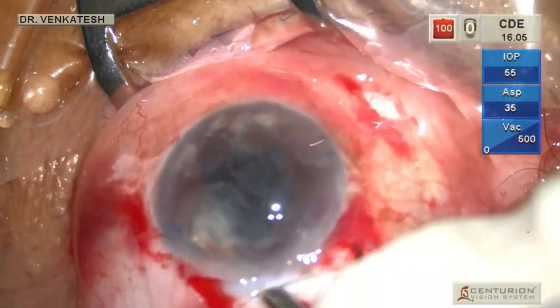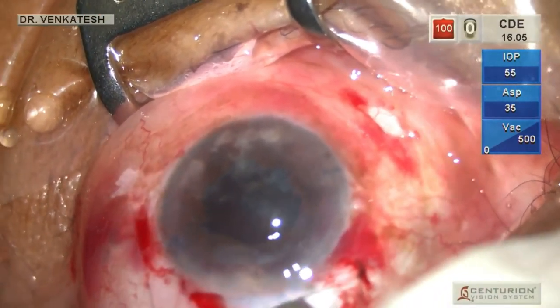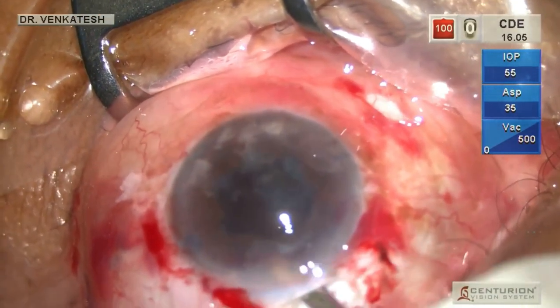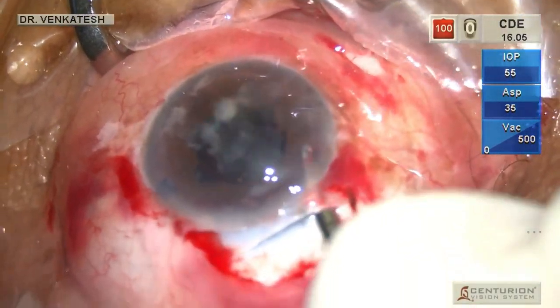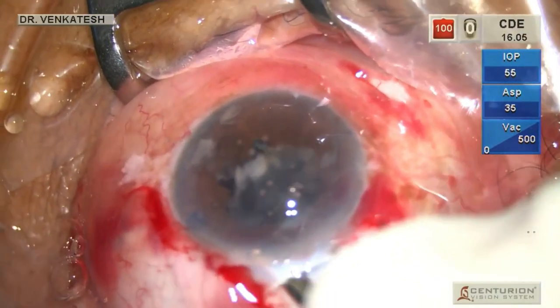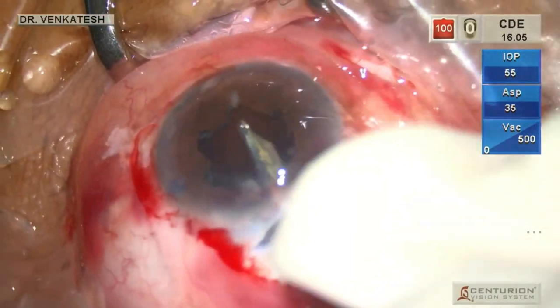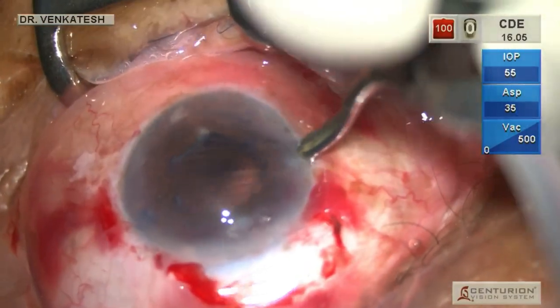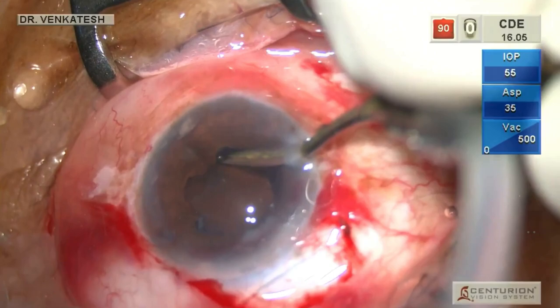Using a Simcoe cannula with irrigation, all the cortical material in the anterior chamber is flushed out, followed by a cortical wash. In such cases there is very minimal cortex and it is very peripherally located. It is always safer to perform cortical wash through the paracentesis in such cases.